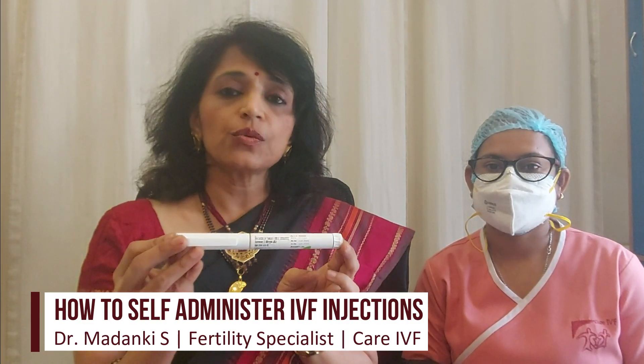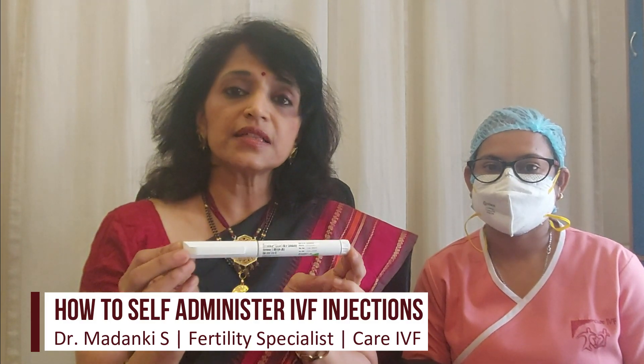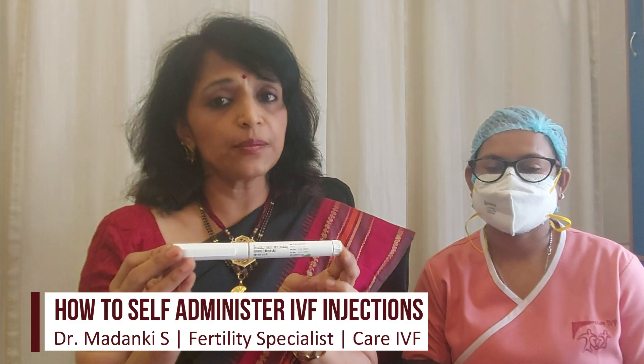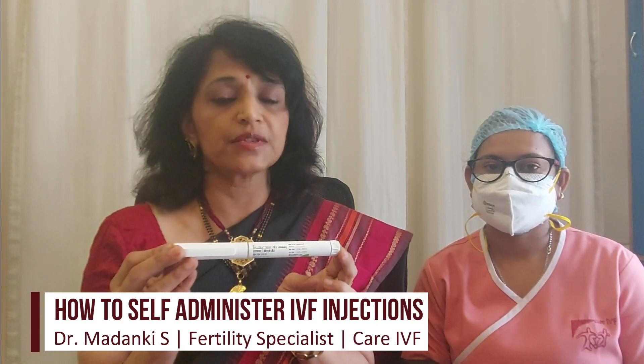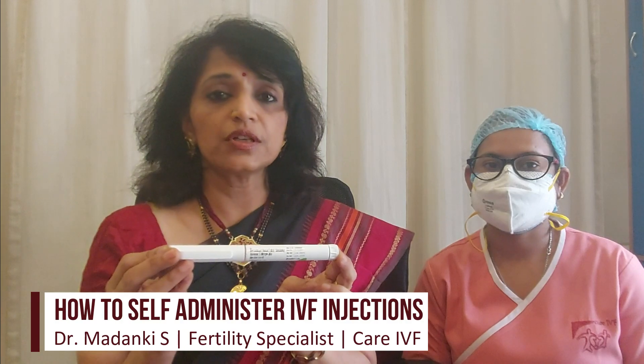So before we start, you must wash your hands clean, dry them, and then take the pen out of the fridge. You also need to keep your prescription alongside and check the actual dosage that you have been prescribed, because you cannot afford to make any mistakes with the dose.